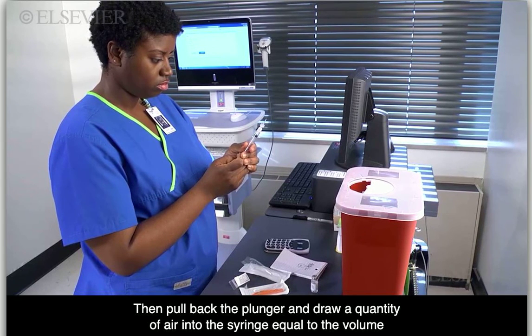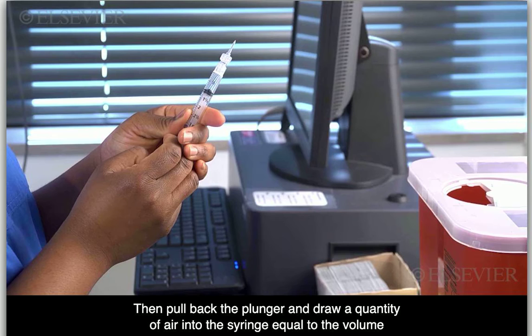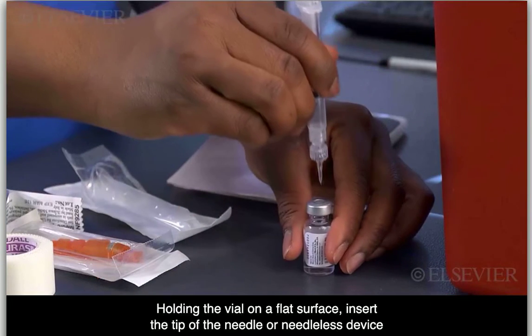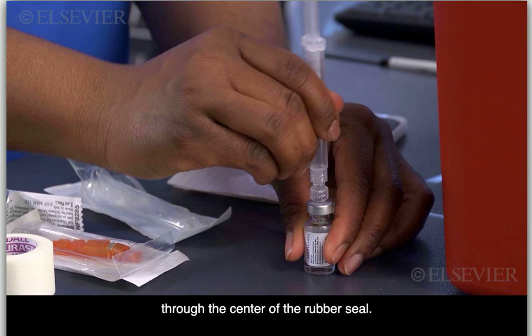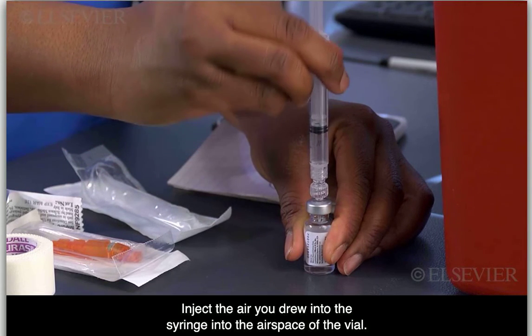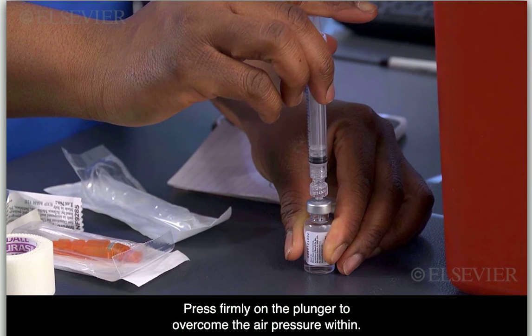Then pull back the plunger and draw a quantity of air into the syringe equal to the volume of medication you intend to withdraw from the vial. Holding the vial on a flat surface, insert the tip of the needle or needleless device through the center of the rubber seal. Inject the air you drew into the syringe into the airspace of the vial. Press firmly on the plunger to overcome the air pressure within.